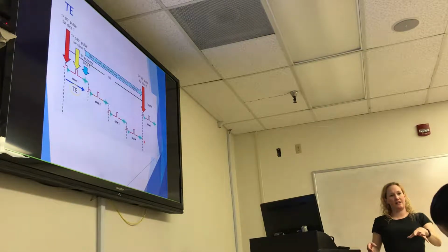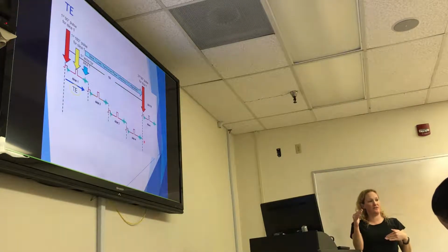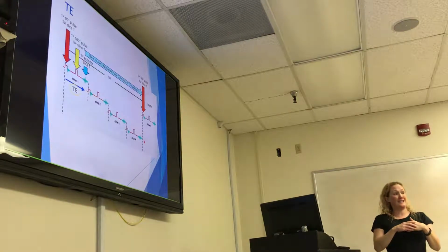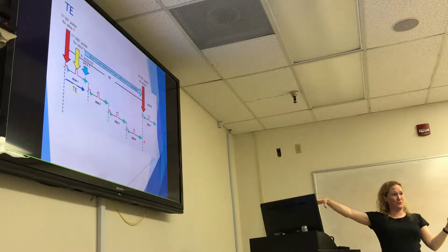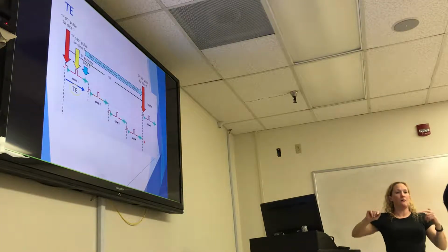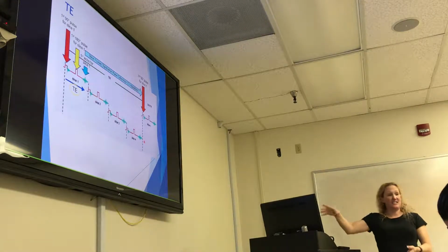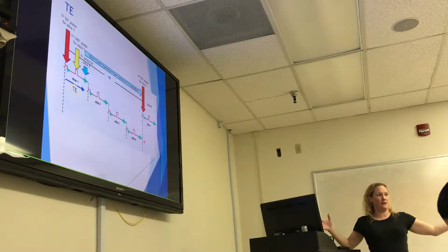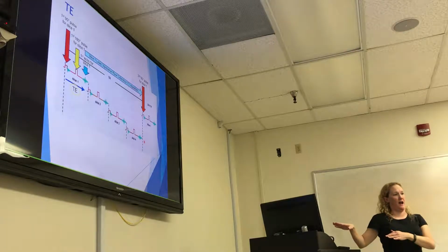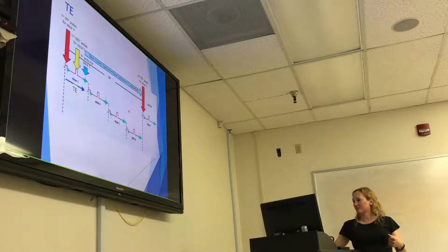And if you've noticed in clinic at all, has anyone experienced the situation where you had to increase the number of slices and it wouldn't let you, right? It's because you've now exceeded the number of slices you can fit within whatever that TR. Now, typically this happens on T1 because it's short, but this is why. It's because we have to be able to fit that TE for every single slice within the time frame of our TR. Sometimes you have too many slices and now you've exceeded that time limit.